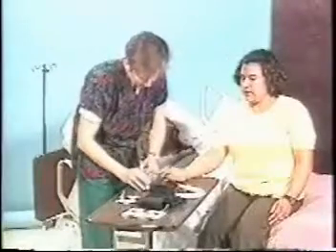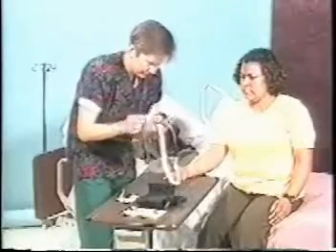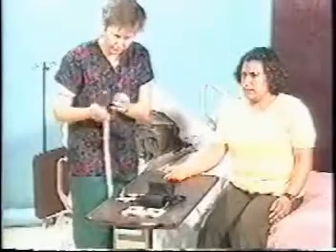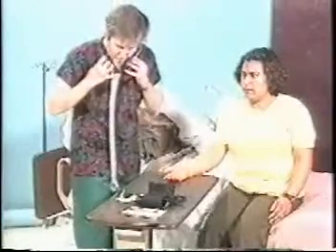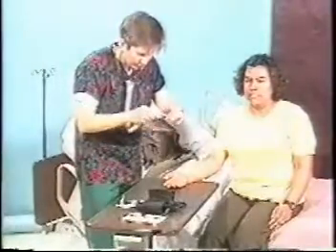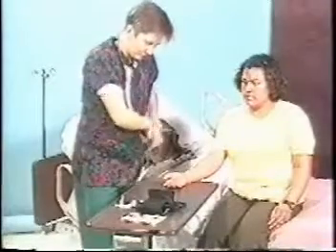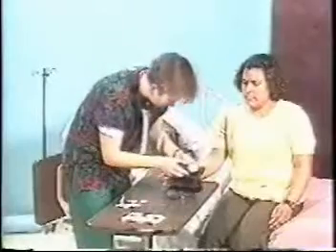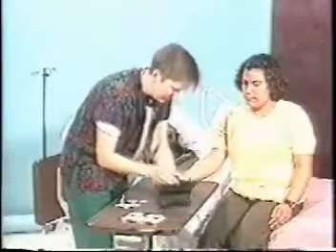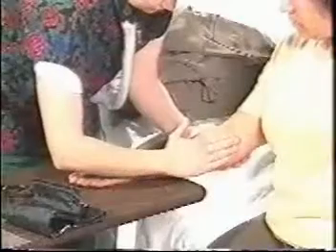Clean the earpieces and the diaphragm of the stethoscope with an antiseptic swab. Point the earpieces forward prior to putting them in the ears. Test the diaphragm and bell to be certain that the tapping sound is heard. Check the gauge that it is at 0 before starting. Palpate the brachial artery.